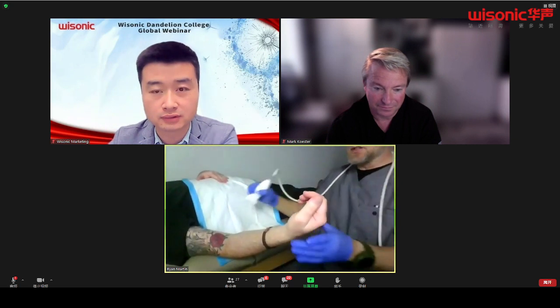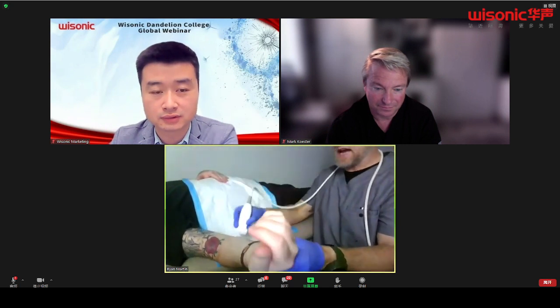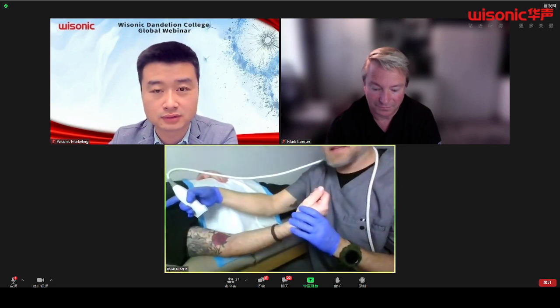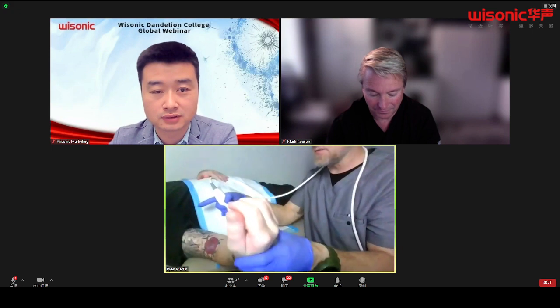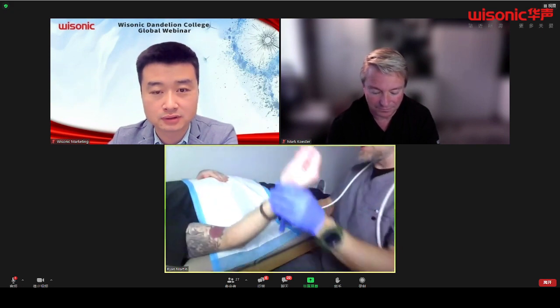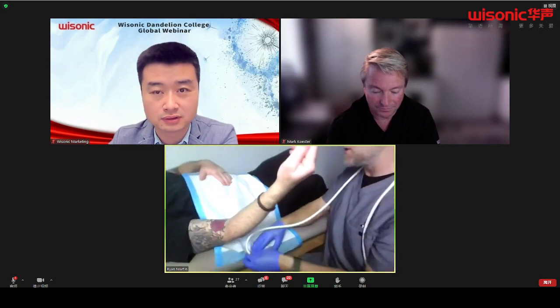There we go. So if I have them here and they're on their back, well, that's a lot of pressure on the elbow. And if they have any shoulder issues, that's probably going to give them some shoulder issues too. So I just have them lay towards me ever so slightly. So Tim, if you can just lay on your side just a little bit here.